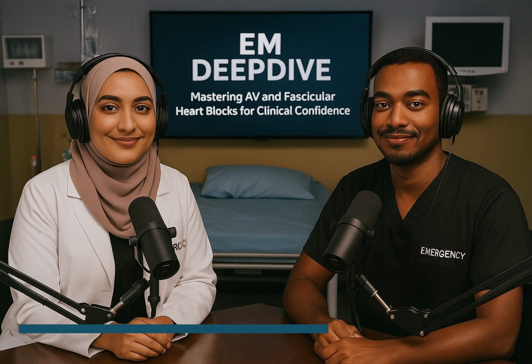Exactly. And here's a key rule to remember. As a rule, RBBB by itself usually has a normal axis on ECG. Whenever RBBB occurs with axis deviation, either left or right, LAFB or LPFB should be looked for to diagnose bifascicular block. That's a great clinical shortcut. If you see RBBB, always check the axis. If it's deviated, think bifascicular block.